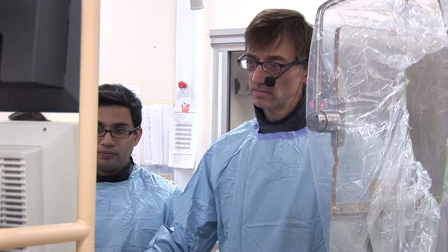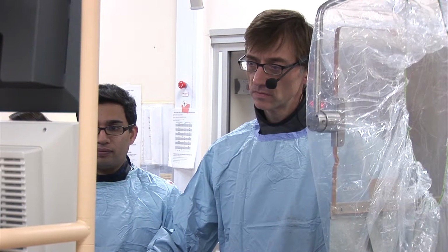and the channel that it has created is now wide enough to allow an angioplasty balloon to be inserted and inflated, so widening the channel with progressive dilatations. Here you see a balloon in one position inflated, and here you see it being inflated in another position. And in another position. So opening up a channel around the wire.